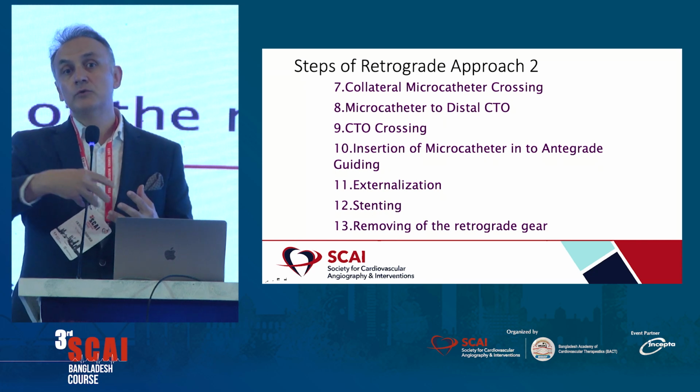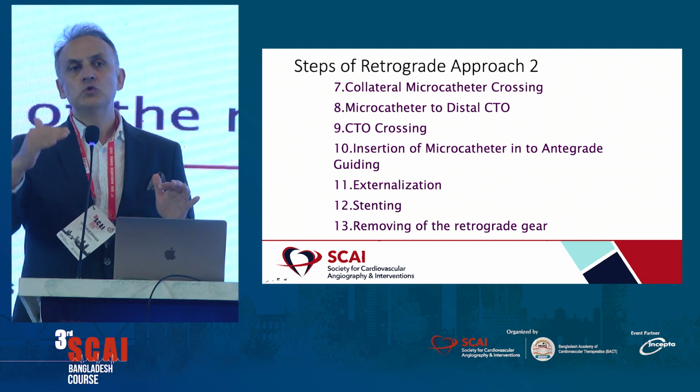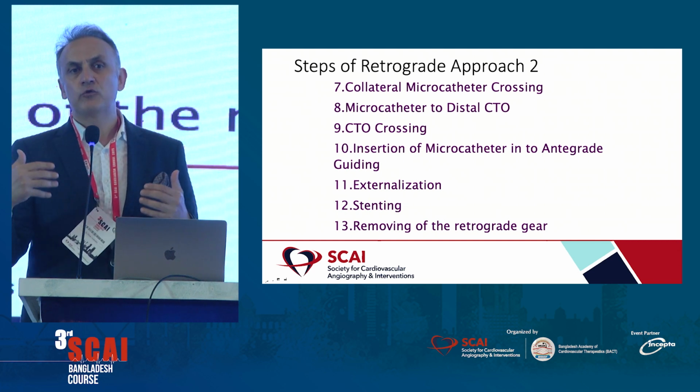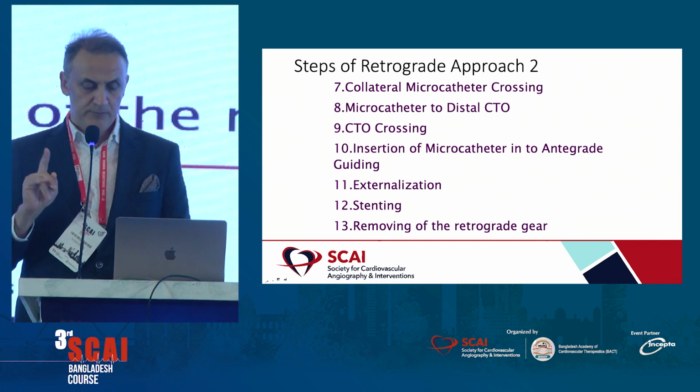And after, we have to remove all gear, and we have to make sure all collaterals are safe. If we use the left system, we have to make sure the left main artery is okay, there is no dissection, anything. So it's very important.